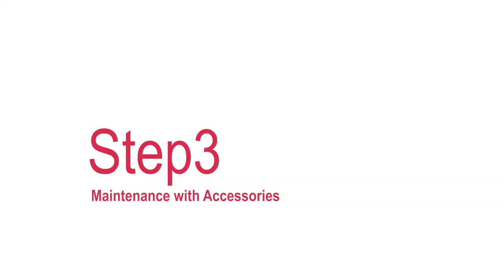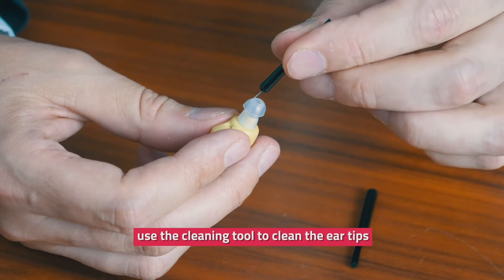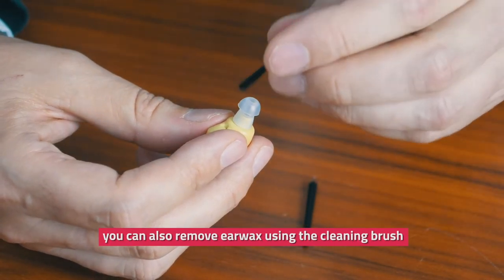Step three: maintenance with accessories. Use the cleaning tool to clean the ear tips — this will prevent the build up of ear wax. You can also remove ear wax using the cleaning brush.